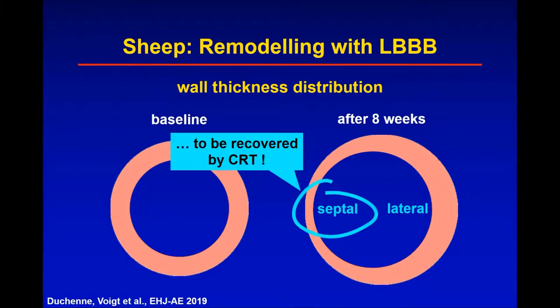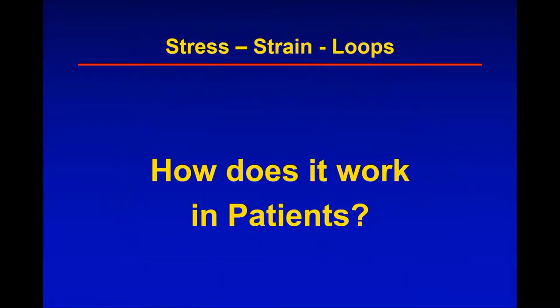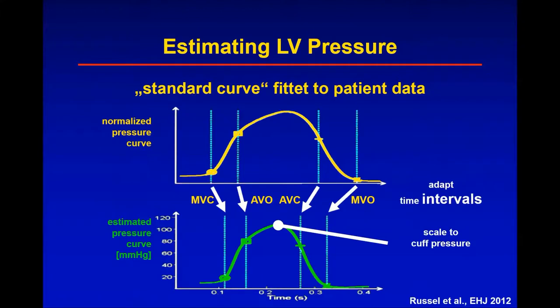And this is what we have to recover when we do CRT in our patients. So we have to recover the function of the septum. So does that also work in patients? Can we measure work in patients?